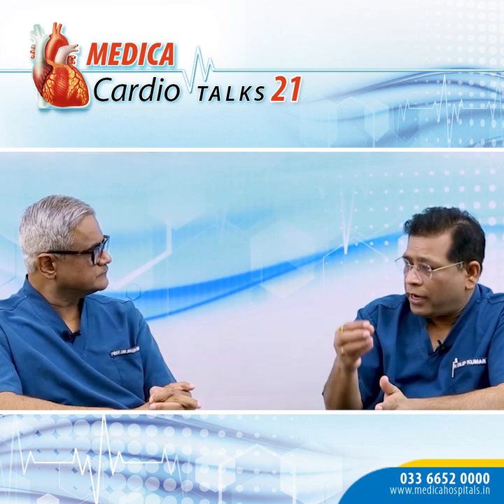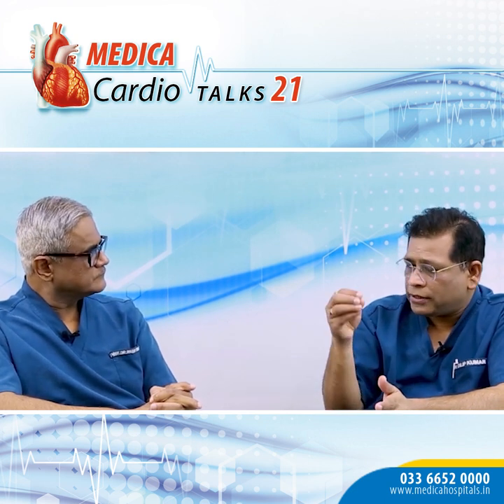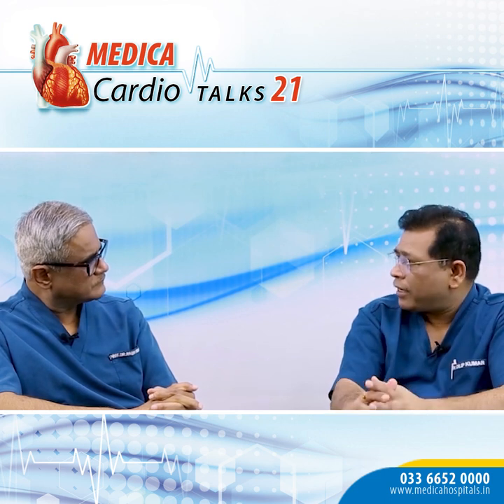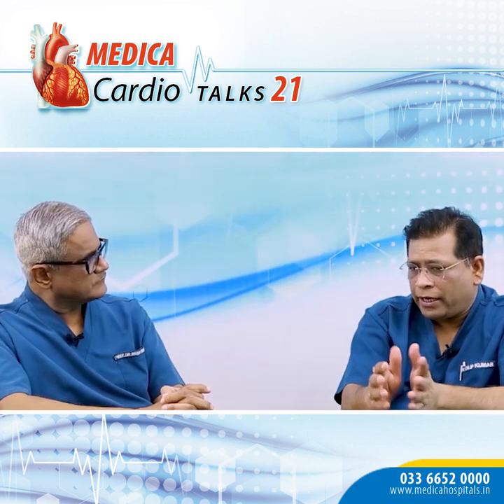Besides that, they have a high chance of vascular complications, more bleeding, and adjacent structures like the coronary arteries can get trauma, because the right coronary artery is next to it, 3 to 6 millimeters posteriorly. So these are the band devices.